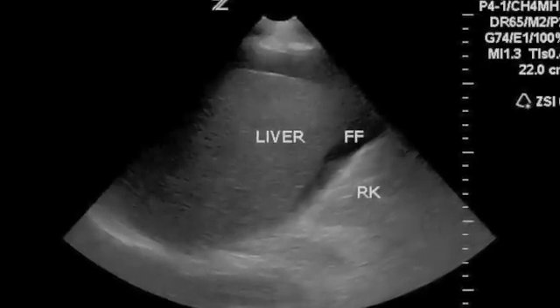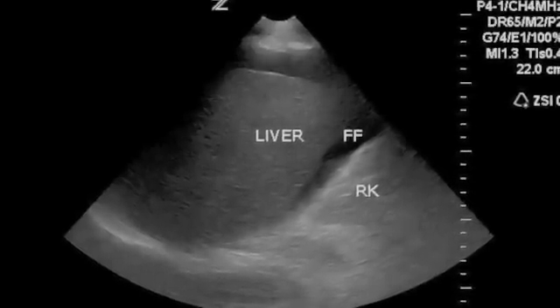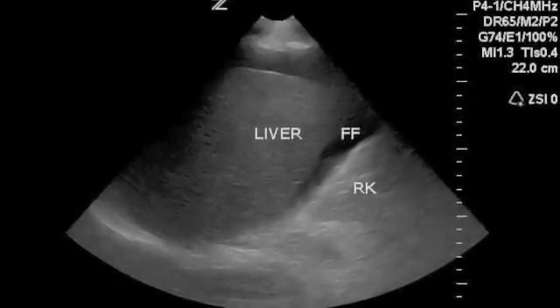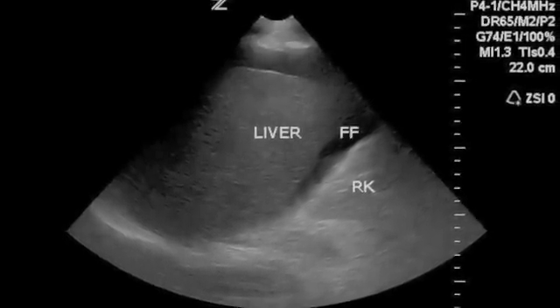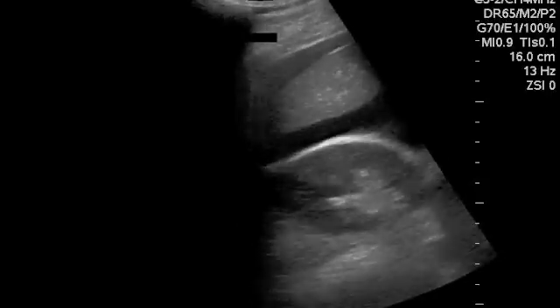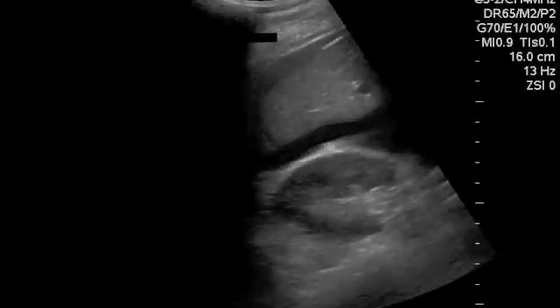Here you can see free fluid in the right upper quadrant, along the interface between the liver and the kidney. Here's a video of the same thing.